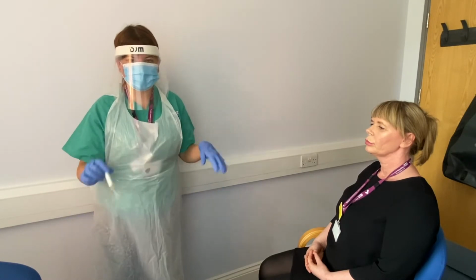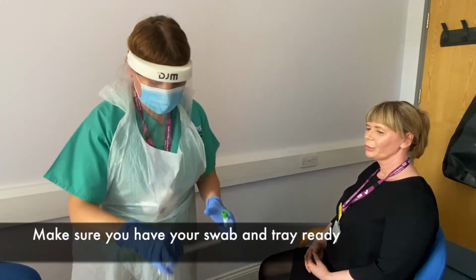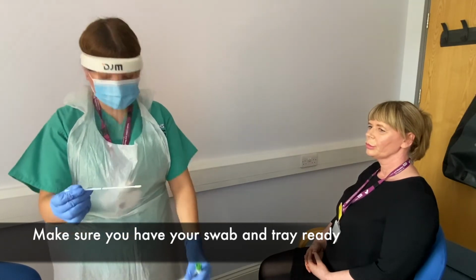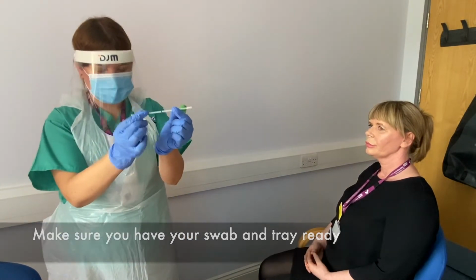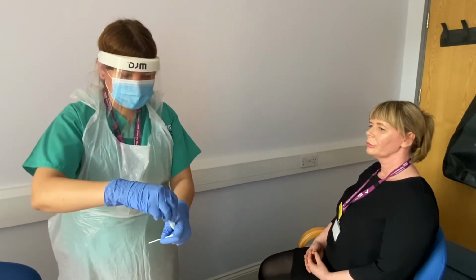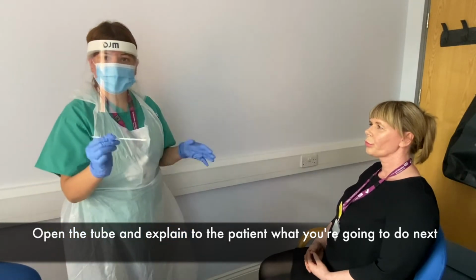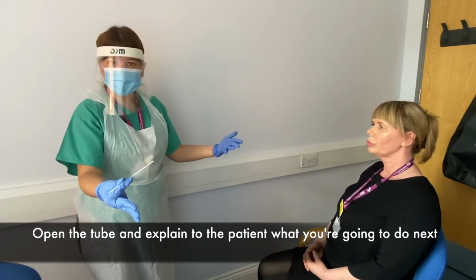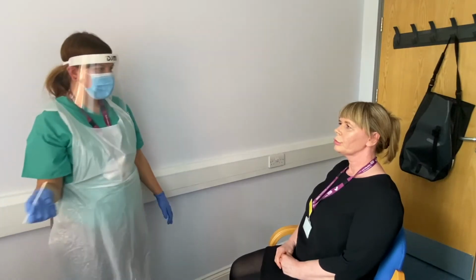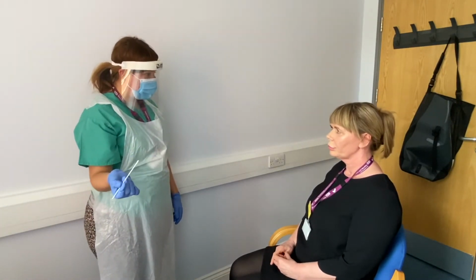One, go. Okay, so now I'm ready to take a sample, and Debbie is going to play the role of a patient. So make sure you have your swab ready, and you will see that the swab is quite long. Make sure you have your tray. Open the tube and have it ready, and then explain to Debbie, your patient, what you're going to do next. Hi Debbie, I'm going to take a sample for COVID-19.